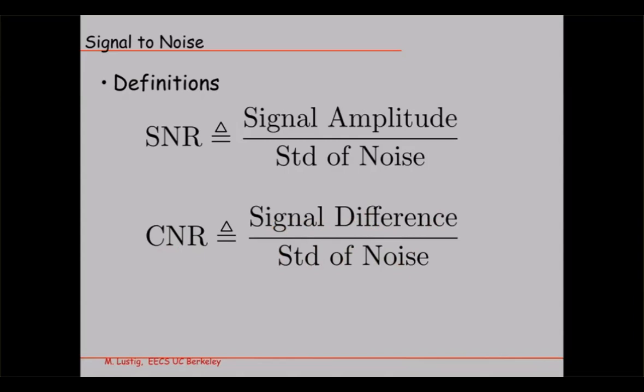Because let's say I have blood tissue that has that much SNR, and I have that much signal, and then the noise. What color should I use for noise? White, because it's white noise. Then this is the noise level, right? So the noise actually modulates our signals a little bit, right? So that's a good signal to noise ratio, right?